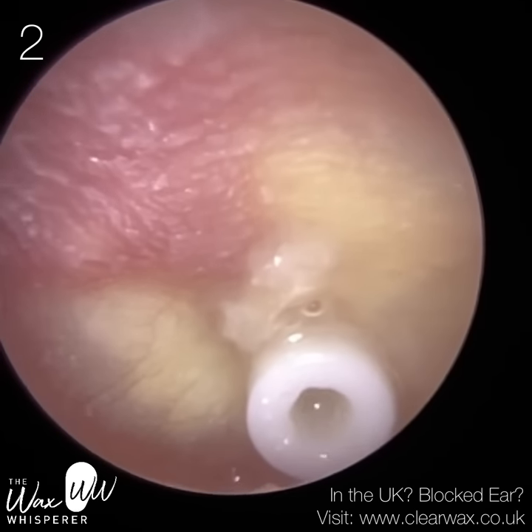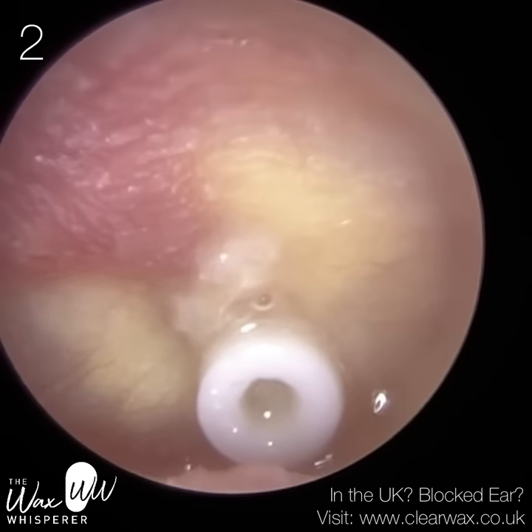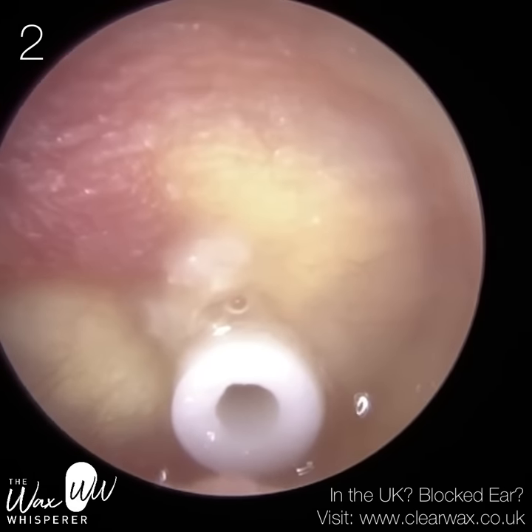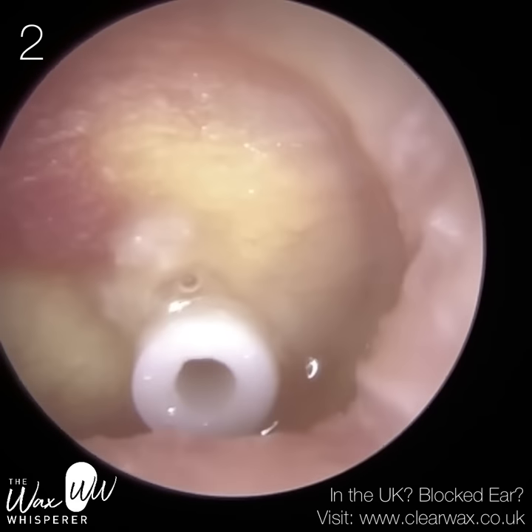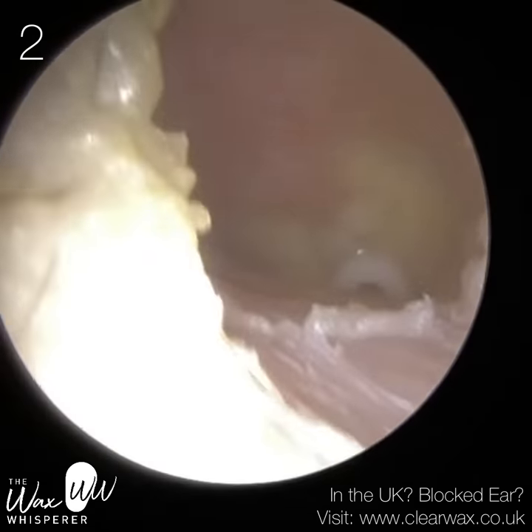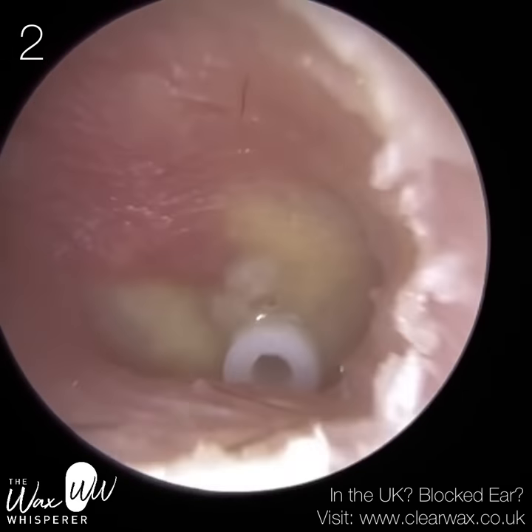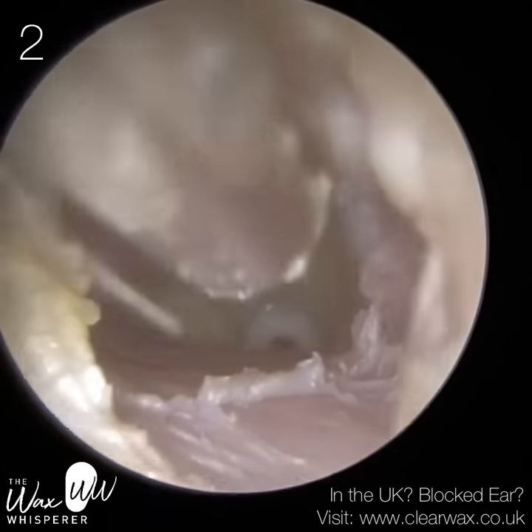You can actually see there — I've cleared a lot of the fluid out, but you can see that fluid is trying to come out again from the middle ear. It's almost like a squeezy bottle: if you tilt it upside down, the fluid wants to come out and just needs a little squeeze. That's what's going on here, and I'm trying to remove as much discharge as possible. But I can't put the suction probe through the grommet — the closest I can go is to the entrance of the grommet.